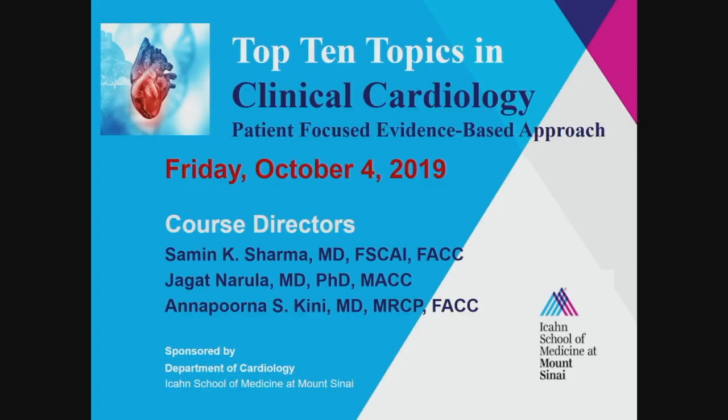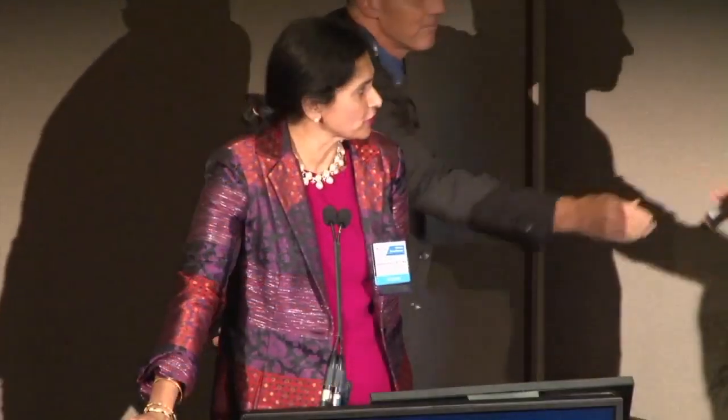For primary MR, you don't have to be on therapy. If the surgeon says the patient has a prohibitive risk, they can go directly to clip. But for secondary MR, definitely those in heart failure with LV dysfunction, we have to make sure that they are on guideline-directed medical therapy, which I think, of all the drugs that I've mentioned, at least 2 of them they have to be on, and still be in heart failure, and we demonstrate that they have mitral regurgitation, then those patients with suitable anatomy will get a clip.